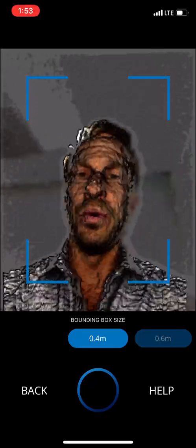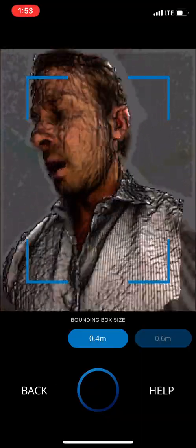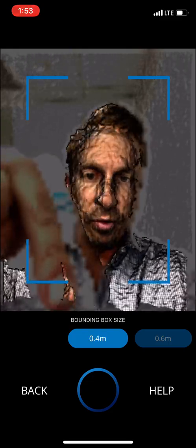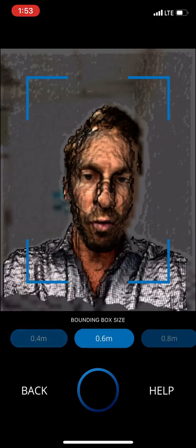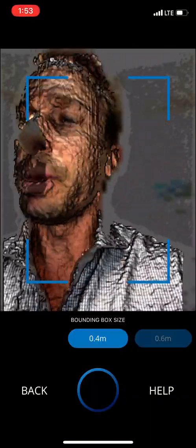I'm going to use this Kleenex box as an example — the Purell is clear, but the Kleenex box more represents what a foot would be like to scan. Take a look here: there's a bounding box size of 0.4 meters. I'm going to swipe this over to 0.6, 0.8, and one meter. For foot orthoses, 0.4 meters is plenty good.